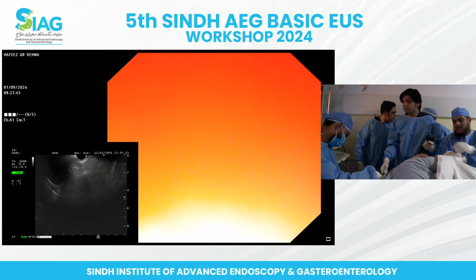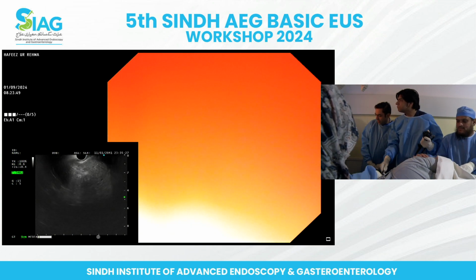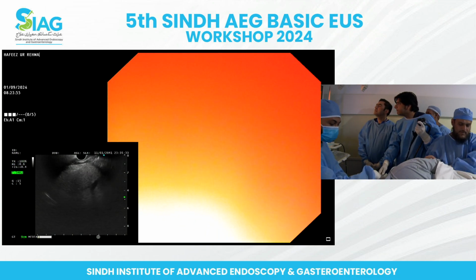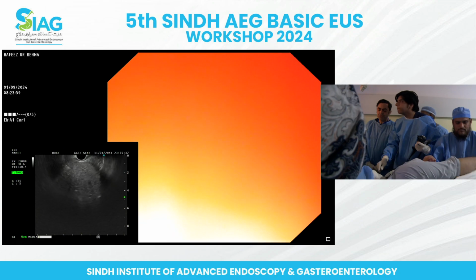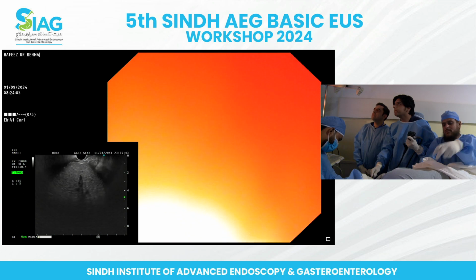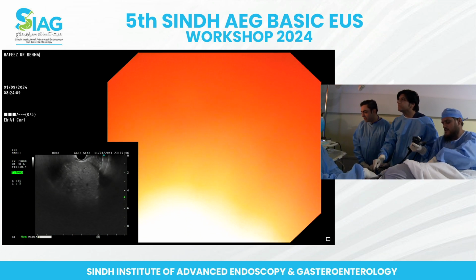अच्छा इसमें ऑटो का बटन होता है, जो ऑटो फोकसिंग का, वो नहीं होता, ठीक है। Excellent. Okay, so yeah, but as soon as you put the scope in at the GOJ, you will see the liver, left lobe of the liver. So you can assess that. So I just wanted to reduce a bit of the gain and see if we can focus it.